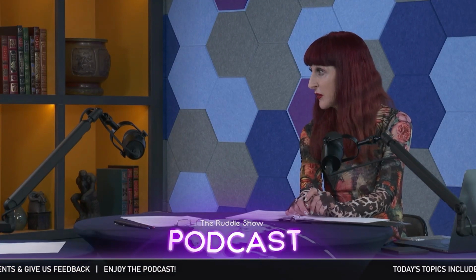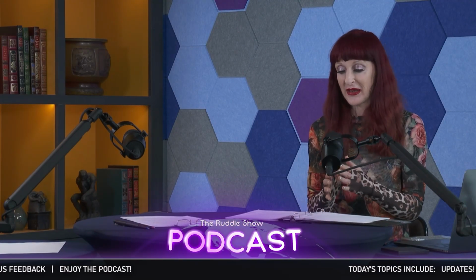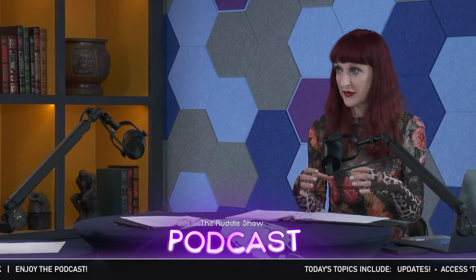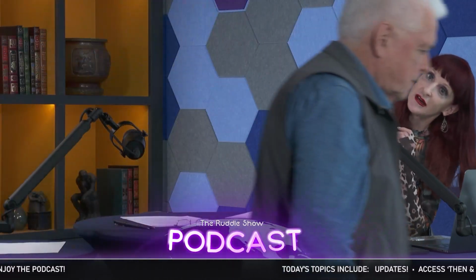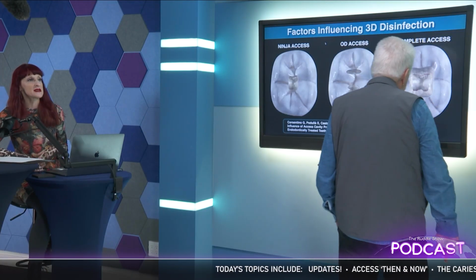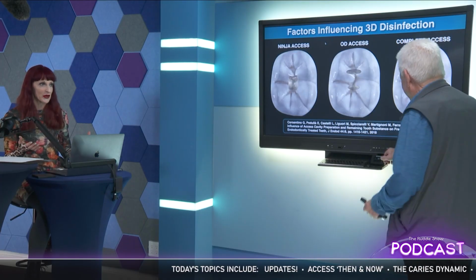All right. While you're going over there, I'll just say this, and we've been talking about for all of the 6 years the importance of removing triangles of dentin. And I've heard you say so many times you want to be able to look into the access cavity and see the orifices without having to really move your head around. And I always kind of thought, honestly, is that just kind of like an OCD thing that you just want your workspace all cleared so you can work easier?